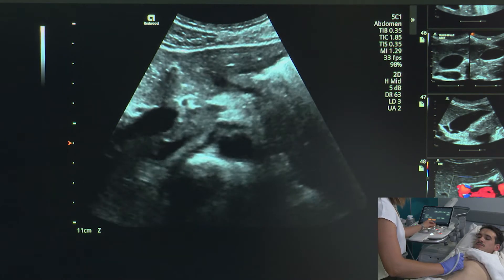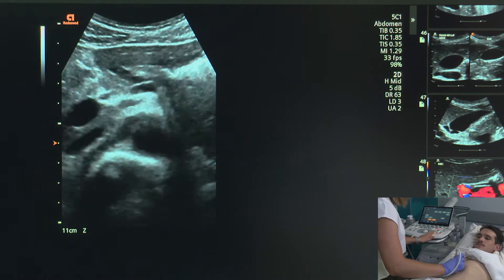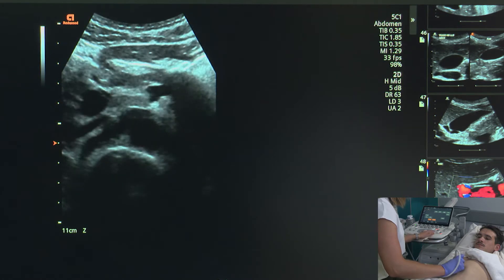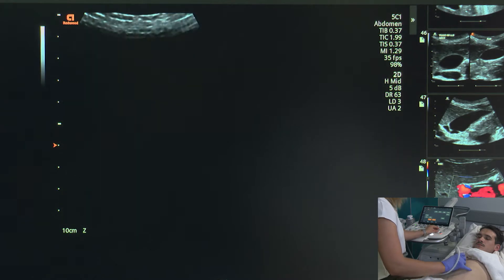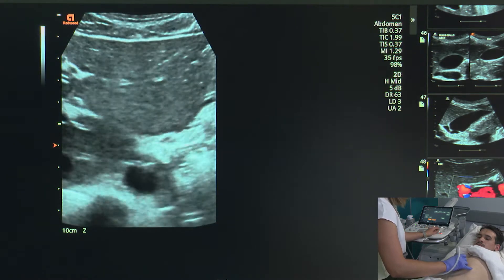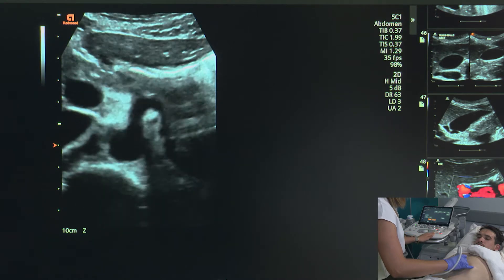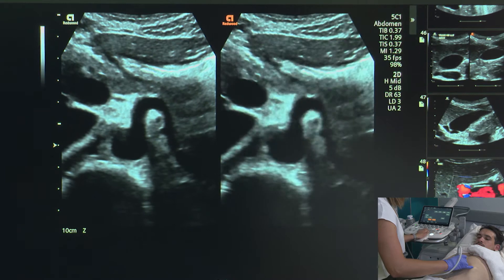I'll first start in transverse and I'm going to do a dual screen. For my superior portion, I'm actually going to use the celiac axis or the celiac trunk as a landmark to take this image. Take a nice big breath in. Here we can see that lovely celiac axis, and I'm going to freeze my image there — breathe normally.